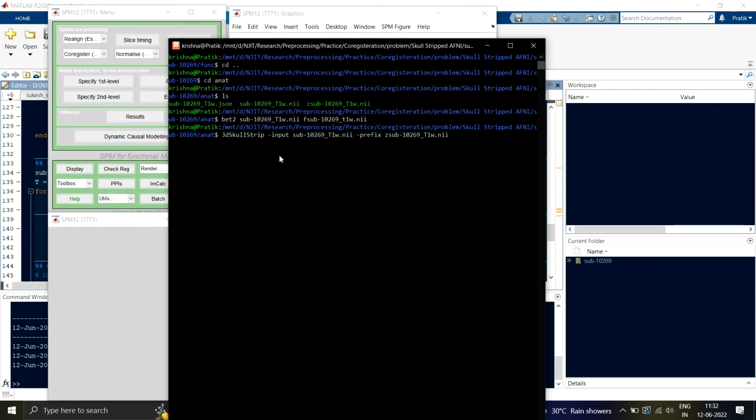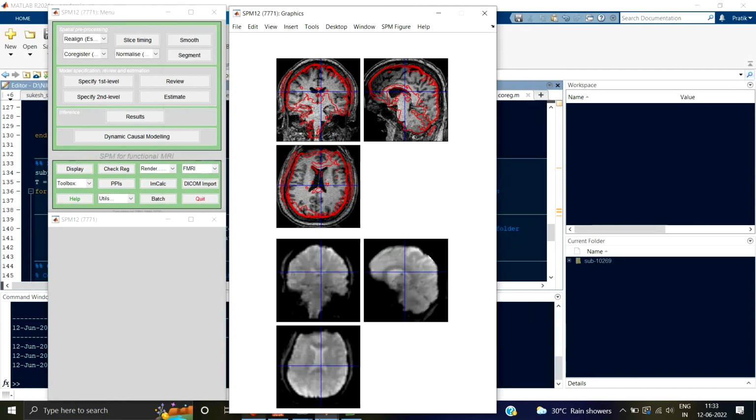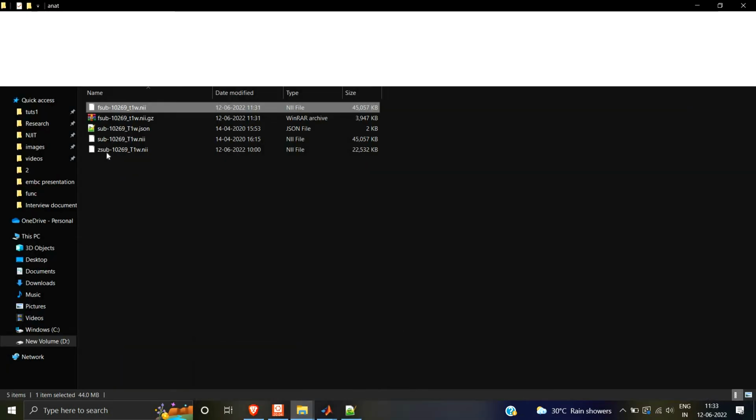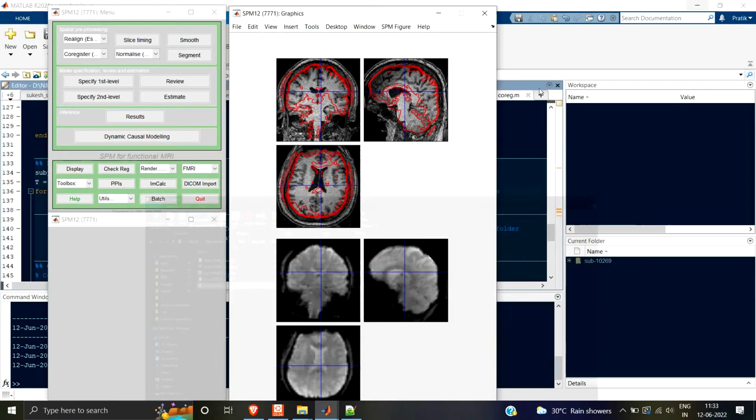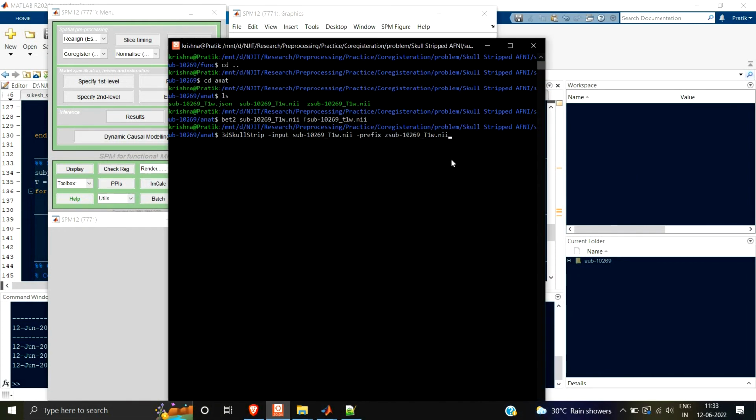and just press enter. This takes a little while depending on which input file it is, I mean, how difficult it is to remove the skull. This might take 2 to 3 minutes depending upon the input image. So what I'll do is I have already done this and I've saved this as a Z file. You can see that over here. So this is with AFNI, this is with FSL. I'll show you now what is the difference between AFNI and FSL. Just press enter over here and you'll get the AFNI skull-stripped file as well.